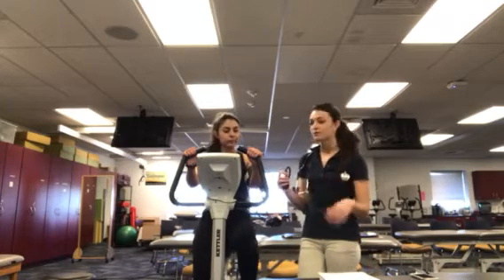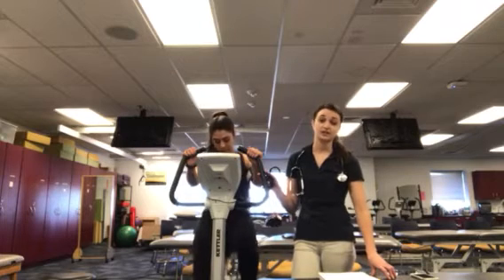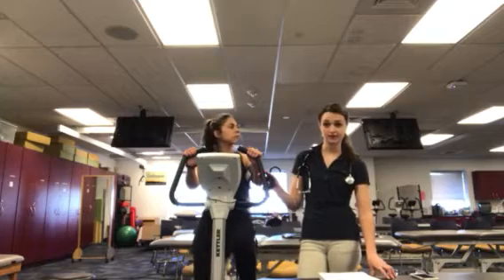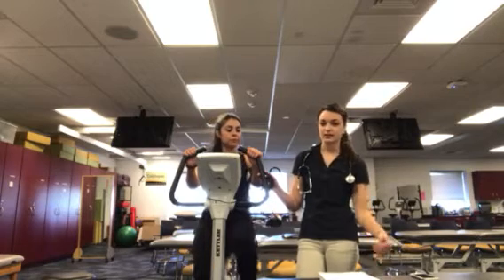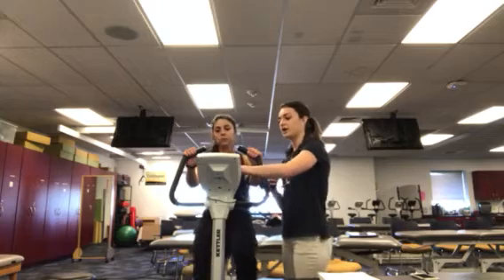So Brooke has been warming up for 3 minutes now at 25 watts and at a cadence of 50 RPMs. The 50 RPMs we will maintain throughout the entirety of the test, and we're going to increase her now up to 100 watts. This is the beginning of our test. Because she is well conditioned, we are going to put her at that 100 watts.